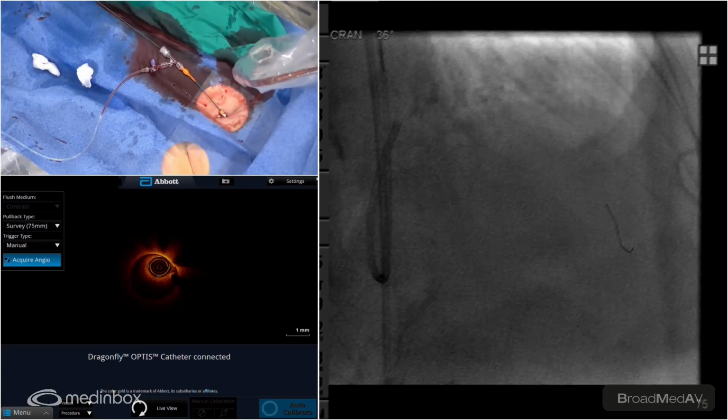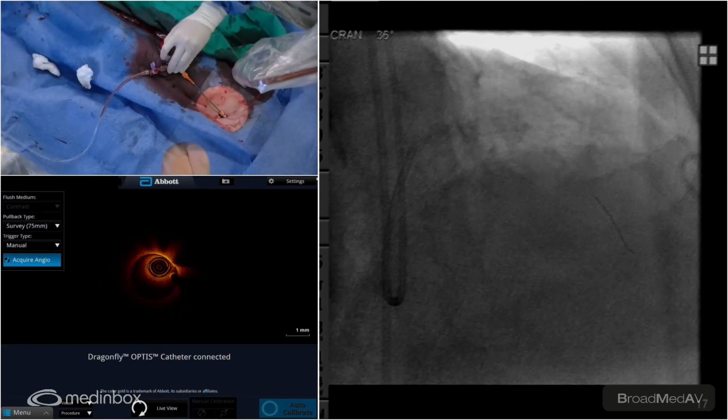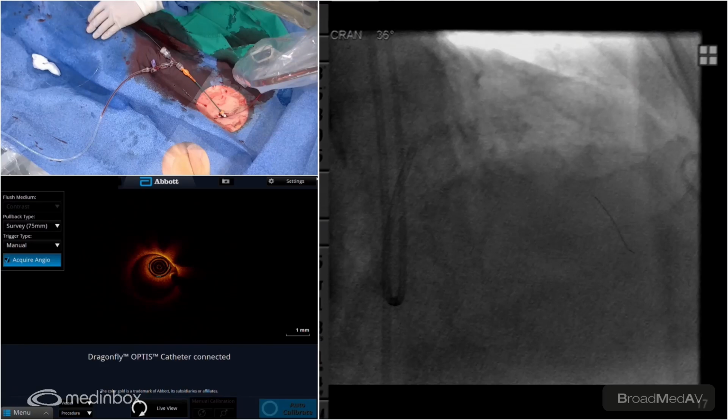Yeah, I'll open this for you. Perfect. So wet one for you up top. Let's do that. Yeah. So we have our 1.5 burr ready to go. I love the loop that you've got there, Amir. I'm not sure if you can see up top what we're dealing with here. We've got the 1.5 burr going in on the RotaPro system. You typically want to start your control right in the middle there and keep it as straight as possible.